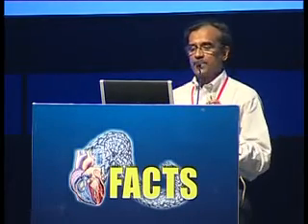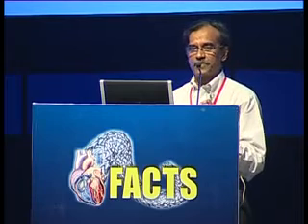That is beyond this presentation because it involves a lot of discussion. I presume that the operator has mastered transseptal catheterization and accessed the left atrium, the LA wire is right across, and the appropriate balloon catheter is chosen for performing the balloon mitral commissurotomy. So the topic mainly evolves around the practical aspects.